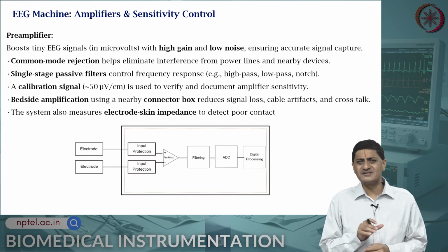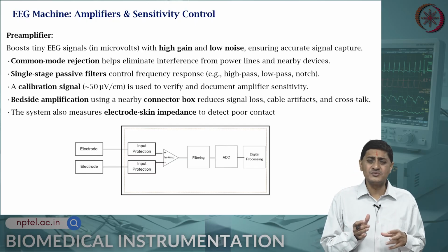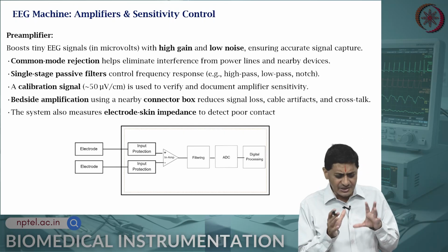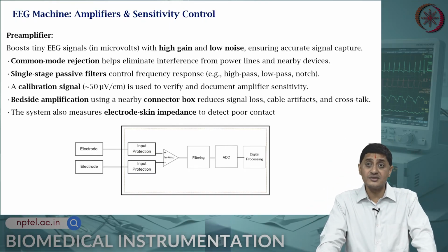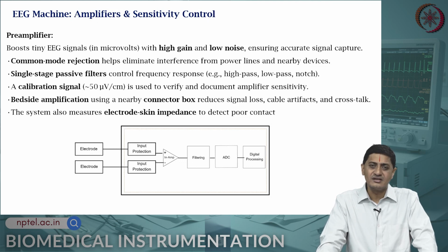Sometimes if a single amplifier has a very high gain, then depending on the situation and which configuration you use, your op amp might saturate. So, there are multiple challenges when it comes to having a high gain system and low noise. Noise must be low, gain must be high. When you amplify, you amplify both the signal and the noise.